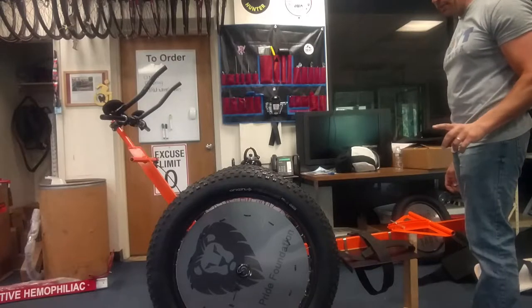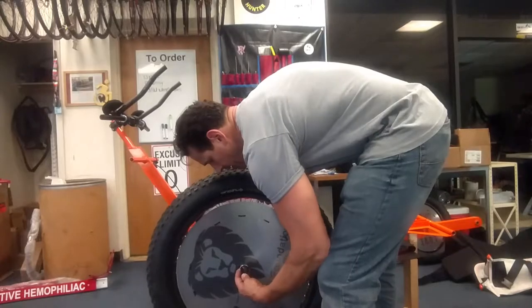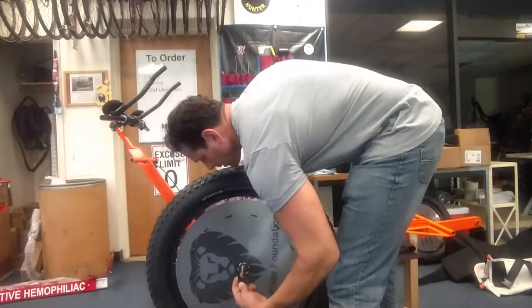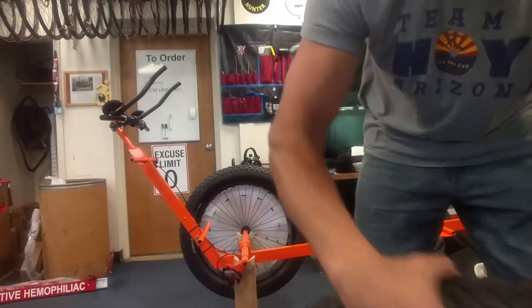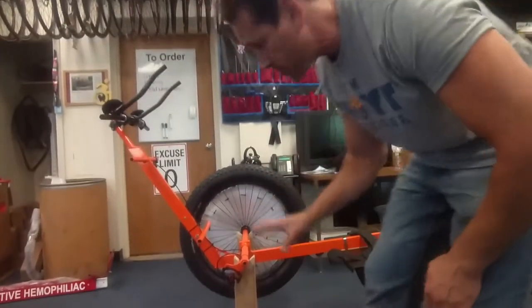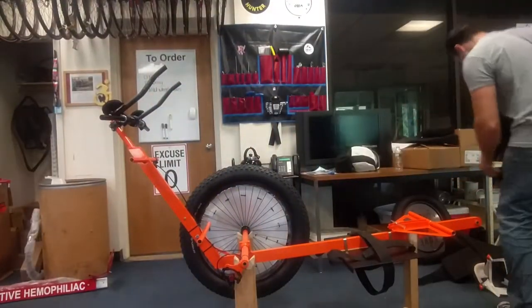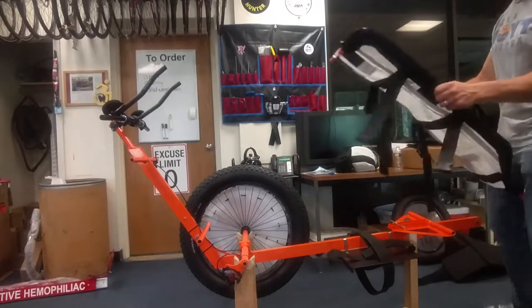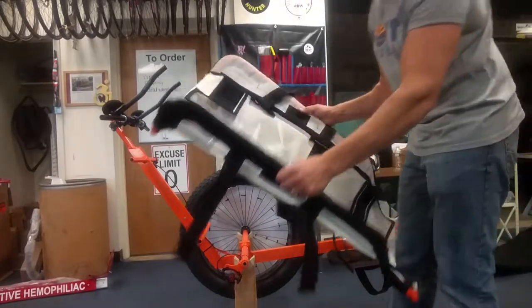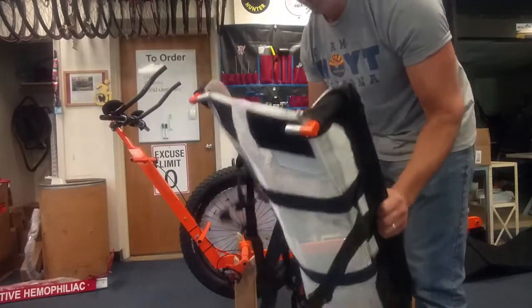Actually, I changed my mind. Because the camera is there, I'm going to take this side off and leave the other wheel on, because you won't be able to see me putting the side rail on — you won't be able to see me putting the cushion on. So I'm going to keep this up here. This is the mesh that you're going to pull out of the box.